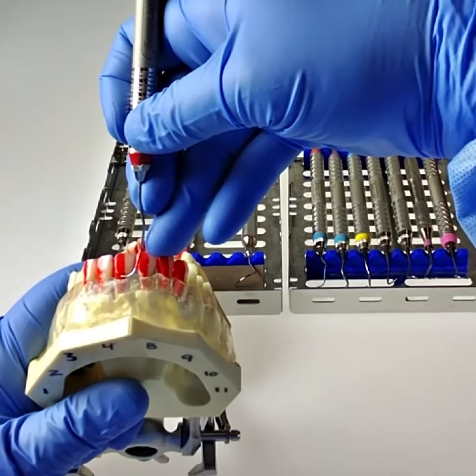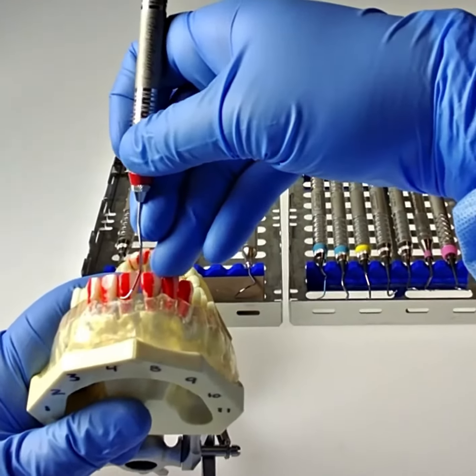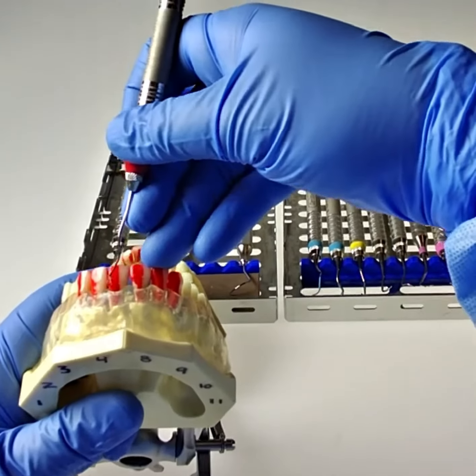Place the side of the toe at the midline and start wrist rocking. At the line angle, start adding a thumb roll to get interproximal.